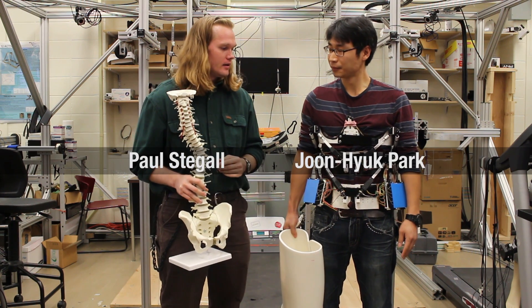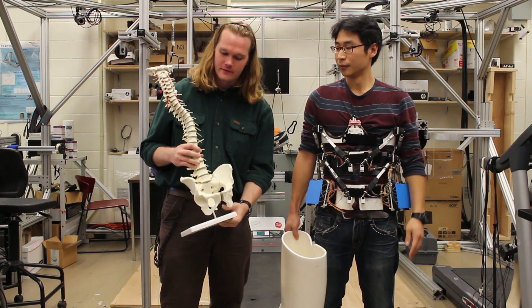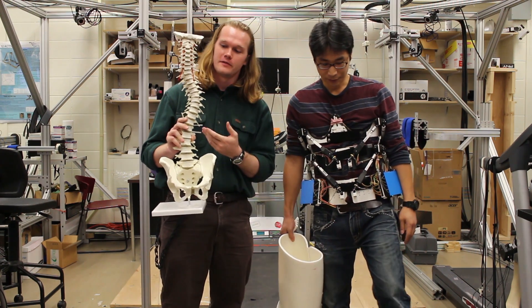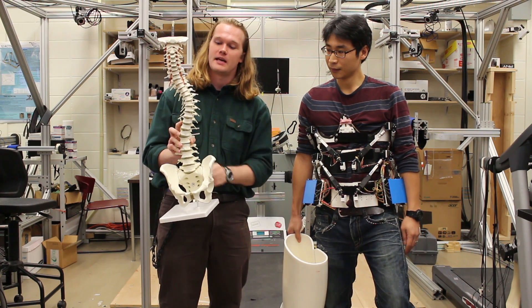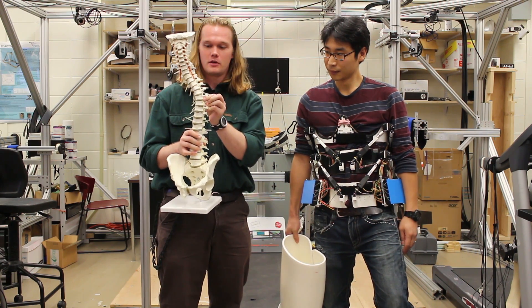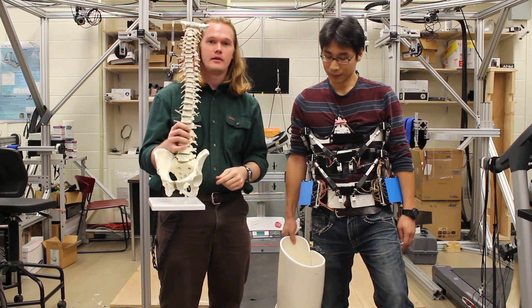This is the Rose Brace, and it's designed to help correct scoliosis. For those that don't know, scoliosis is an abnormal lateral curvature of the spine — essentially the person's spine would have a curve somewhere in the middle that pushes out to the side. The goal of the brace is to help push this curve back into alignment, so you end up with a more straight and normal spine.